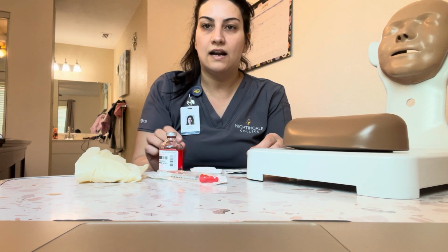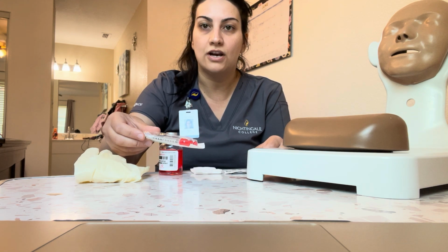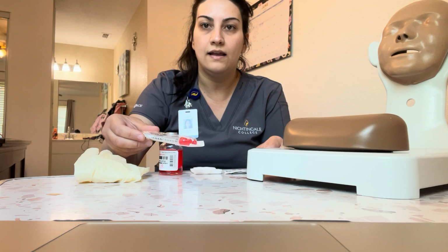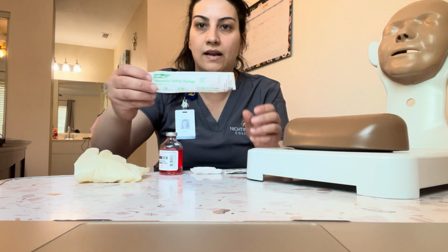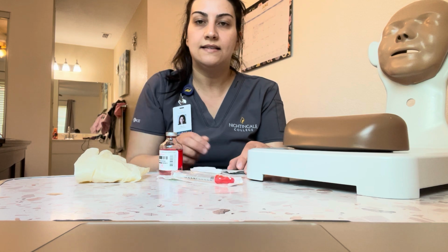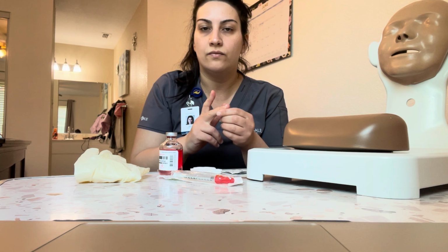The syringe that I will be needing for this injection is a 29 to 30 gauge, half-inch needle, 1 milliliter syringe. I'm going to be using this one due to supplies. Next, I'm going to go over the 6 rights of medication. Right patient, right medication, right dose, right route, right time, and right documentation.